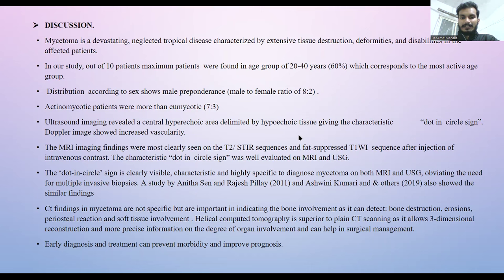A study by Anitha Sen, Rajesh Pillay, Ashwini Kumari and others also shows similar findings. CT findings in mycetoma are not specific, but are important in indicating bone involvement as it can detect bone destruction, erosions, periosteal reactions, and soft tissue involvement. Helical CT is superior to plain CT, as it allows three-dimensional reconstruction and more precise information on the degree of organ involvement and can help in surgical management. So, early diagnosis and treatment can prevent morbidity and improve the prognosis.